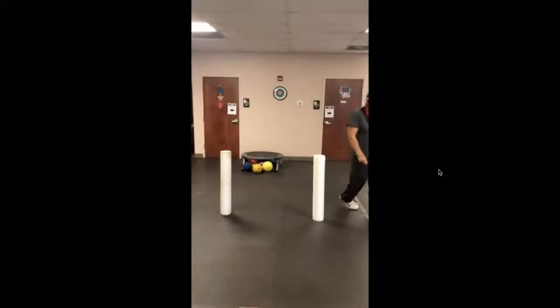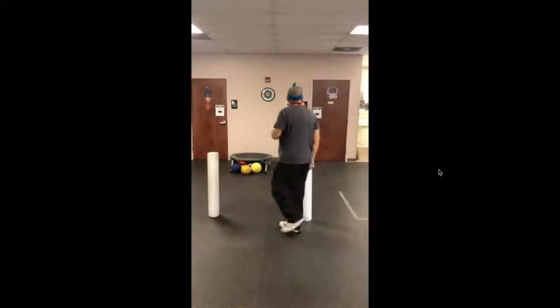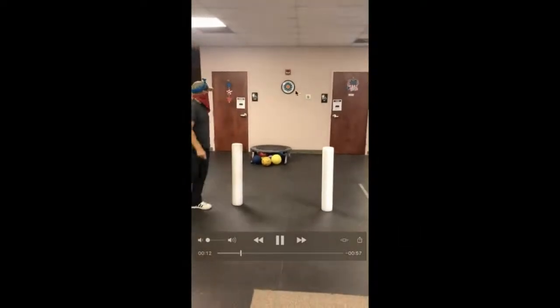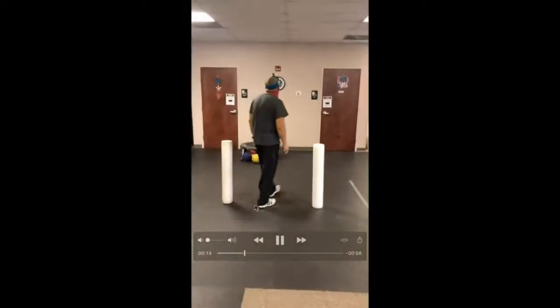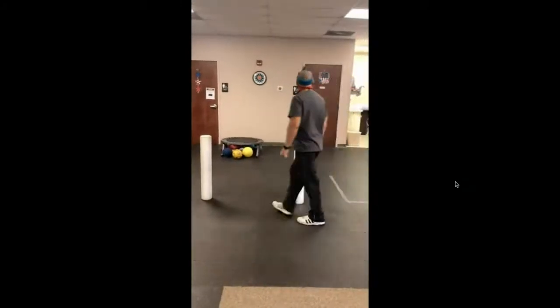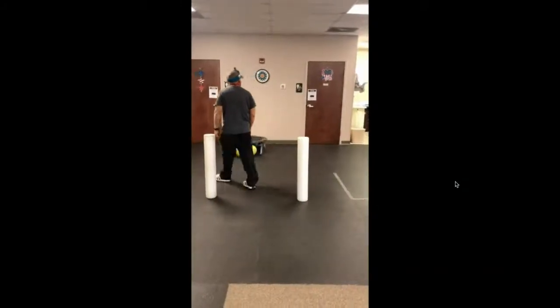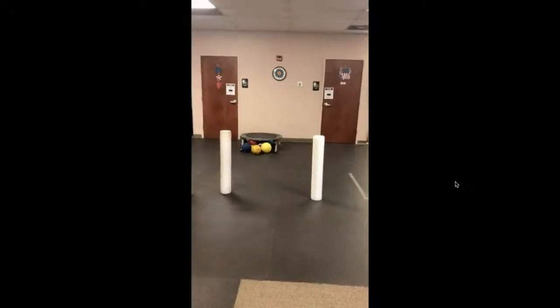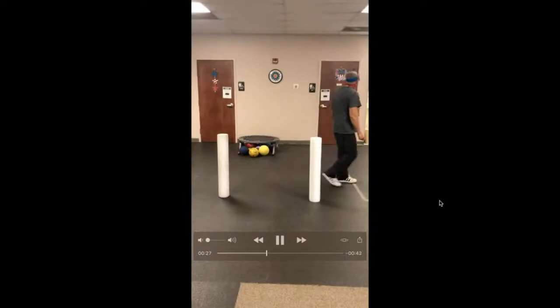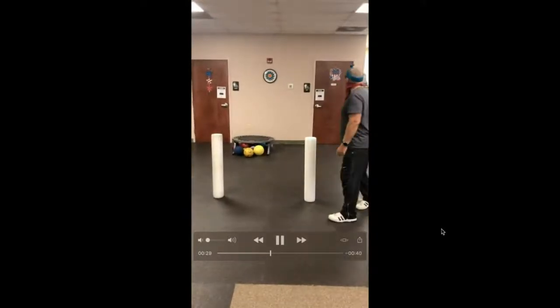So look at the lag, and when that laser actually gets back on there, he's already past the foam roller on this side, and he's at the foam before the foam roller on this side. So we have a little excursion measurement that we can go through there, a distance measurement. And again, he just can't get that right rotation coming back around. His visual field is not fixating quite as well on that target as he comes back around that side.